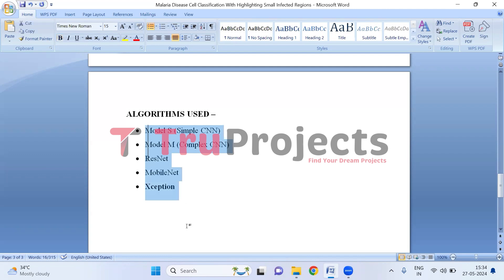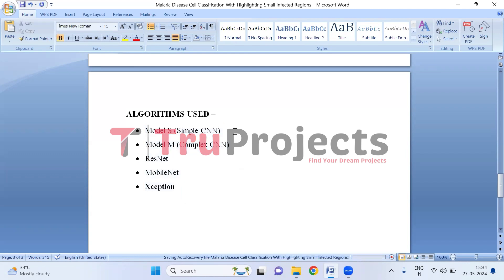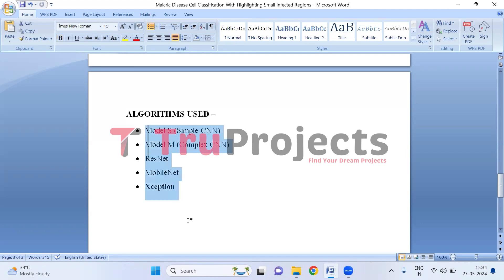These are the algorithms built in the project: Model S (Simple CNN), Model M (Complex CNN), ResNet, MobileNet, and Xception. We built all these algorithms to compare performance with different evaluation metrics like accuracy, precision, recall, and F1 score. The Xception model outperformed the other models and that is the reason we have deployed it in the front end.